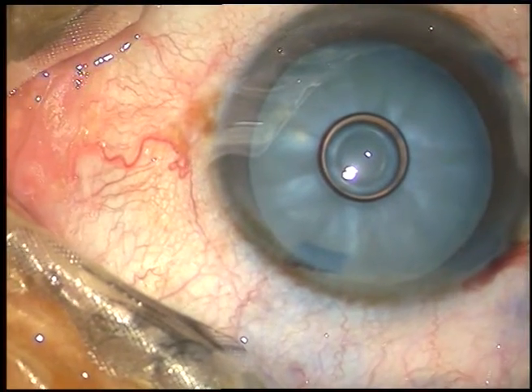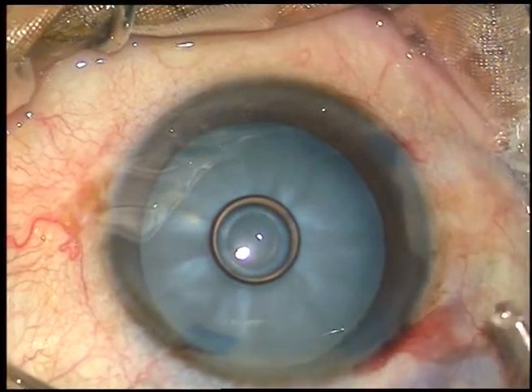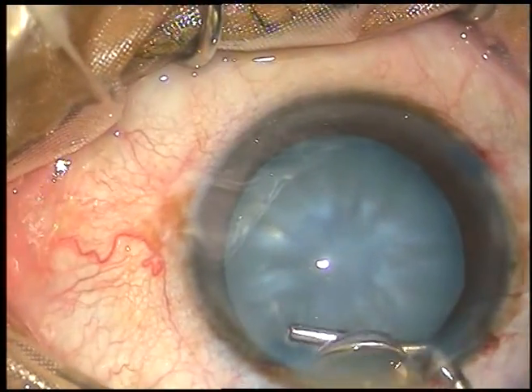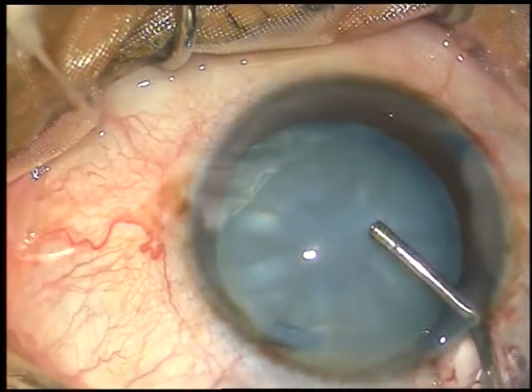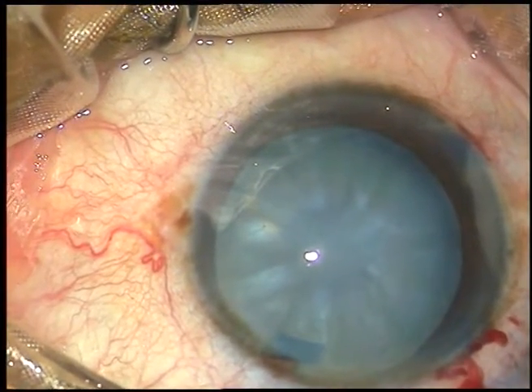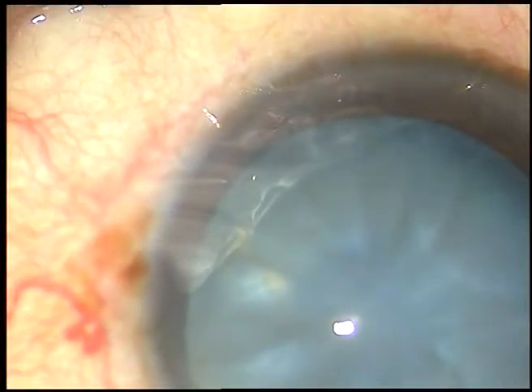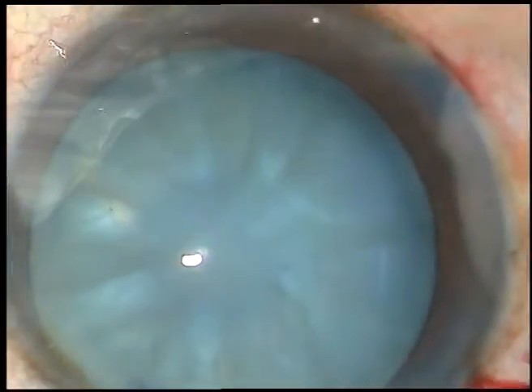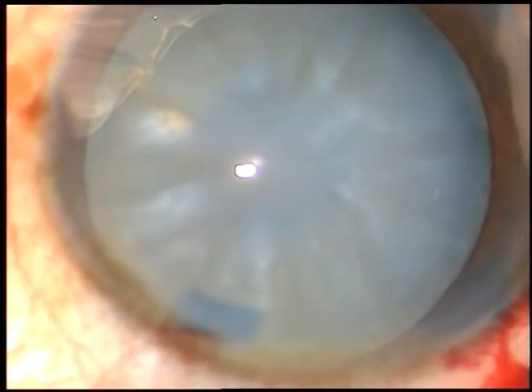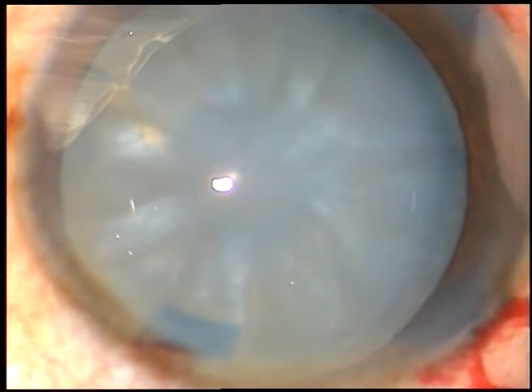And now, capsulorhexis — the most challenging part of intumescent cataracts. Once the rhexis is done nicely, the surgery is just walking in the park. And see how it can be done.